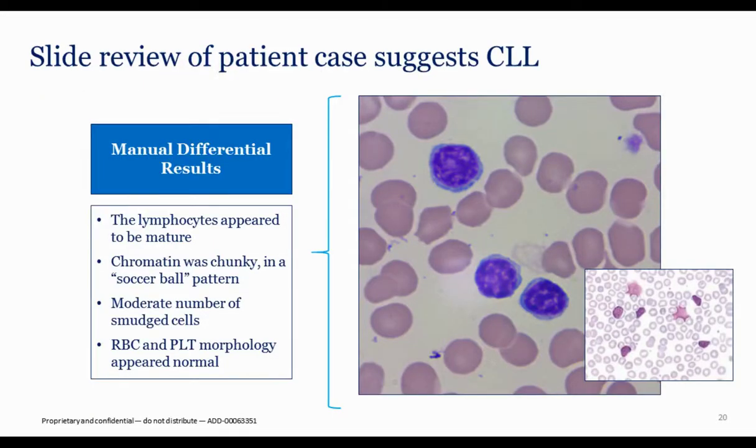This is a peripheral blood smear from a patient with CLL, and what you'll notice on the right is these mature appearing lymphocytes. They're immuno-incompetent. It's somewhat of a monotonous picture, whereby they all look about the same. And if you look at the little insert to the further right, you'll see the presence of 2 smudge cells. So these would be those fragile lymphocytes that we were talking about on the previous slide that might have an increase in fluorescence on some analyzers, but certainly we would see these on a peripheral blood smear as a result of making the smear manually, since the cells are fragile.